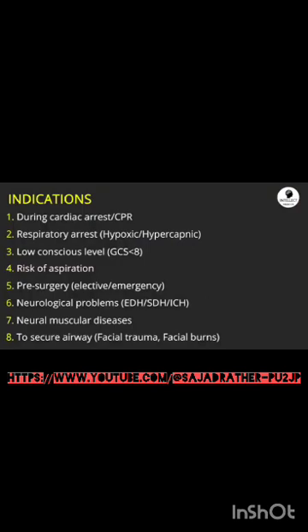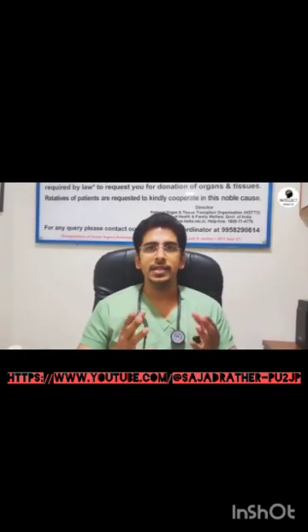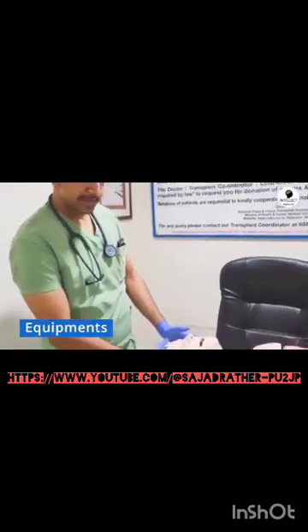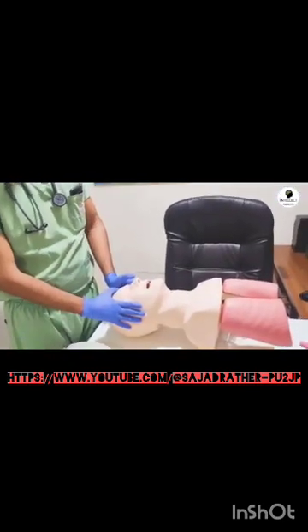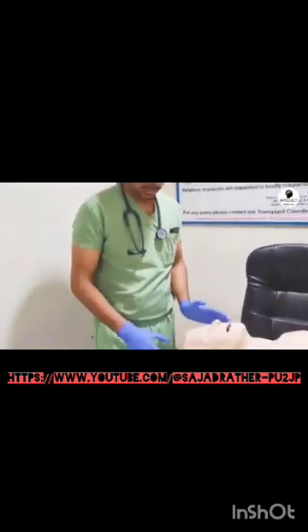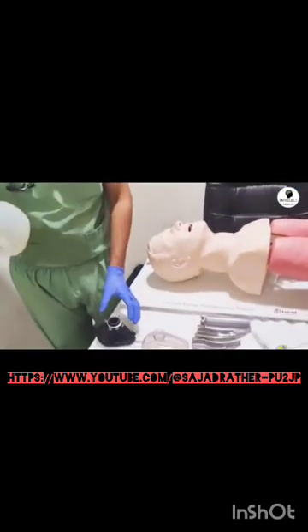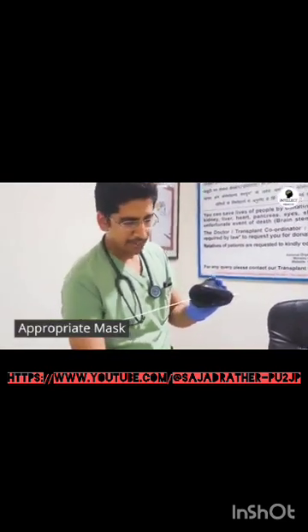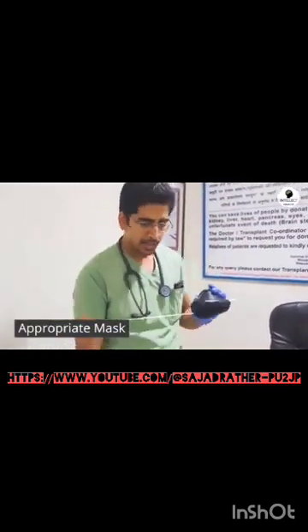Now coming on to the equipment which is required during intubation. So talking about the equipment which we use. First of all, this is our mannequin or dummy on which I will demonstrate the whole procedure. And this is our resuscitation bag. This is the mask. We need to have different sizes of mask.